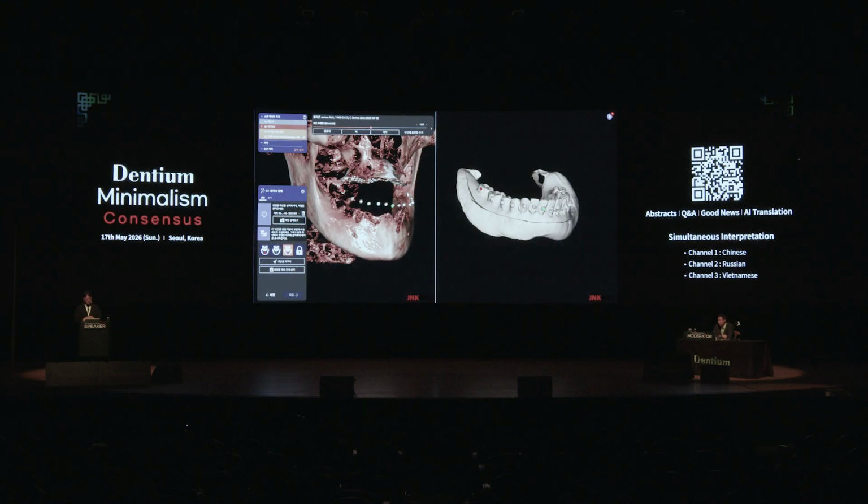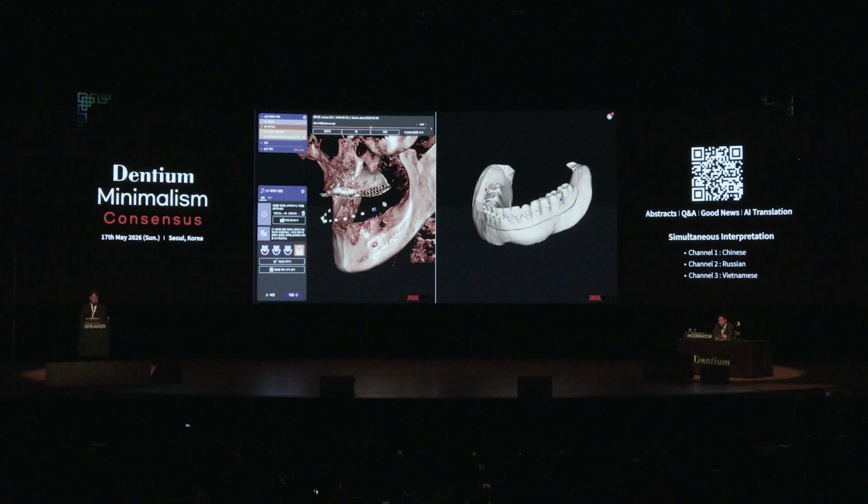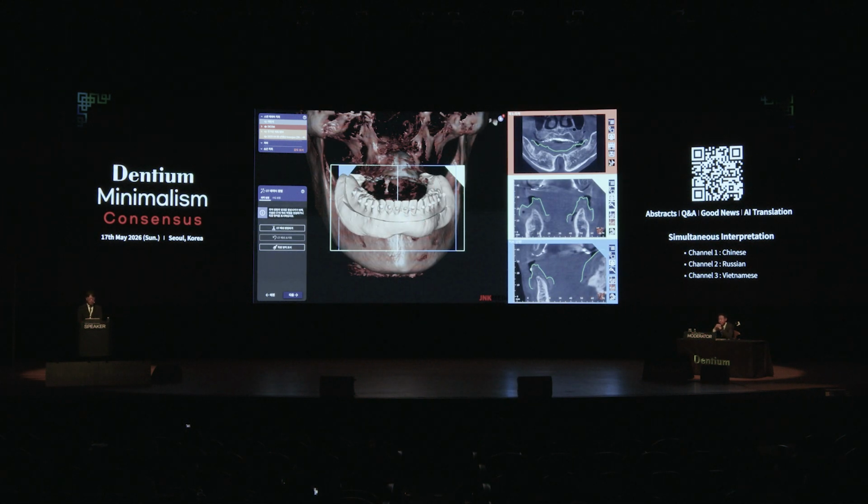For implant planning, we need to align the intraoral scan data with CT data. CT data does not show soft tissue well, so in an edentulous patient, an indirect method for alignment is required. Therefore, we made a duplicate denture with markers and used it for data alignment. Now we can see that the data is well aligned based on the fiducial markers.